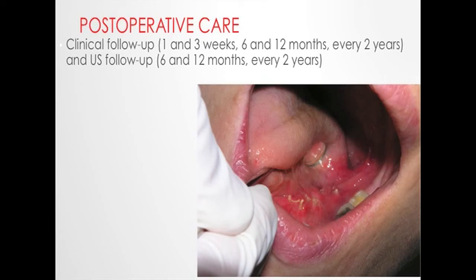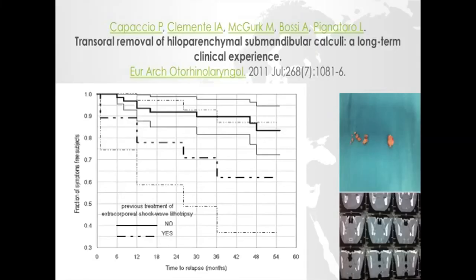Postoperative complications are very limited. We just have a few ranulas and a few hilar stenoses that are the main persistent complications. The postoperative care is important to verify the secretion of the salivary duct system and also the ultrasonographic evaluation to verify patency of the ductal lumen and the hiloparenchymal region. This is a recently published manuscript, together with the school of Professor McGurk, where we demonstrated that we have some residual fragments after transoral surgery.